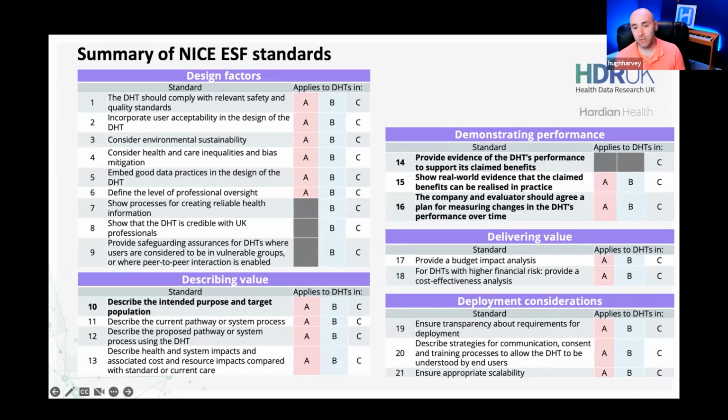Real world evidence to show that they're actually claimed in practice. So showing that actually when you put the device in the hands of your intended users, those benefits are being realized. And again, you can do that pre-market in your clinical investigation, or you can do it post-market in your post-market clinical follow-up. And then 16, recognizing that software doesn't maintain its performance over time because of performance drift and the changing IT environment, or indeed the changing health environment.